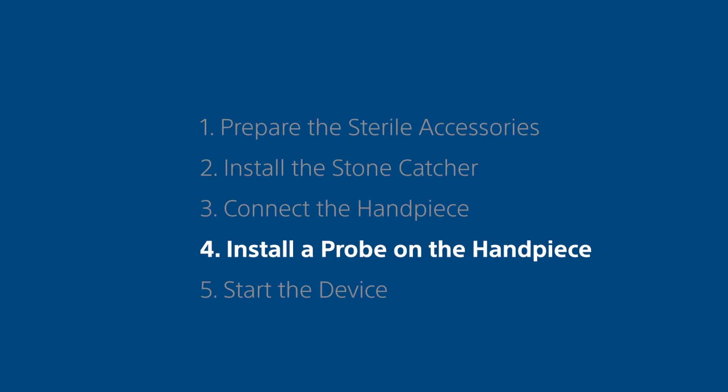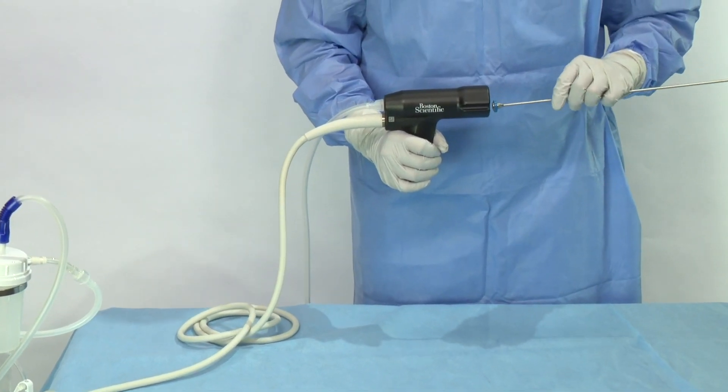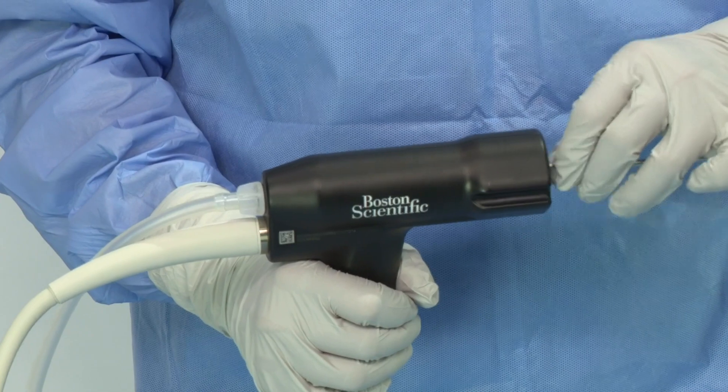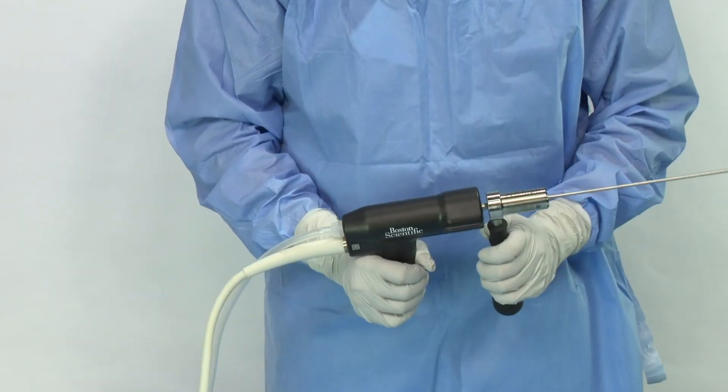Step 4. Install a probe on the handpiece. Screw the appropriate sterile probe to the handpiece. Use the torque wrench to firmly tighten the probe.